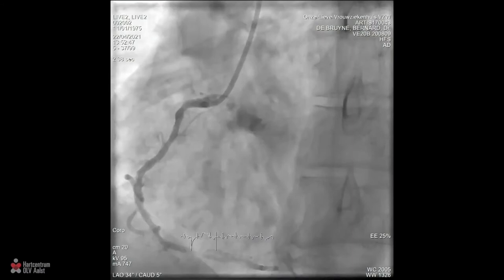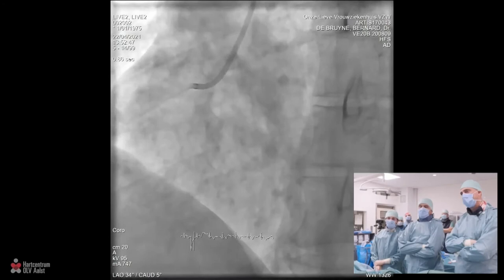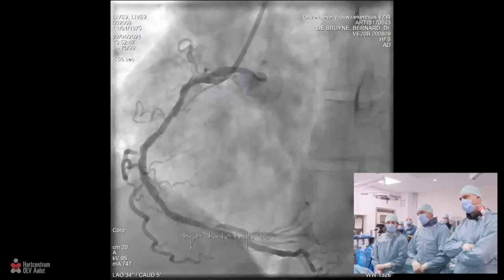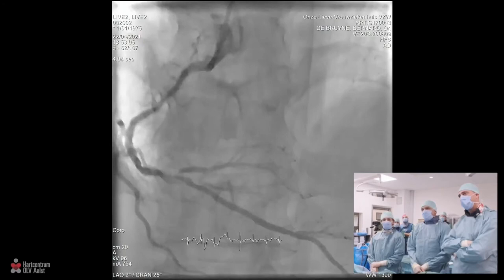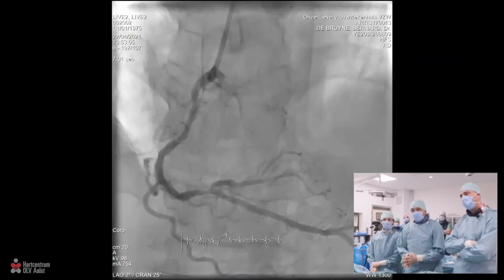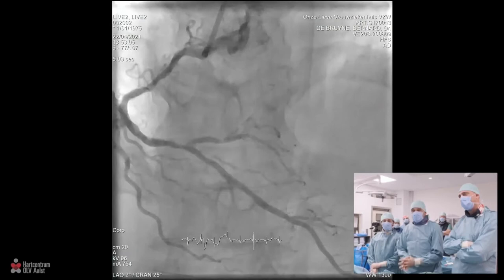As far as the right is concerned, diffusely diseased, and in the crux of the right, we see a lesion which is probably a little bit more pronounced on the posterolateral branch than on the PD of the right. Again, this is something that we have to investigate invasively. Show the next one, Tom. That's excellent. Here we'll see it probably a little bit better. Yes, we see the ostium of the PL branch, which is angiographically, again, significantly diseased. We always say significantly diseased. Please remember that this is a gentleman who is running triathlon and never experienced any type of symptoms.